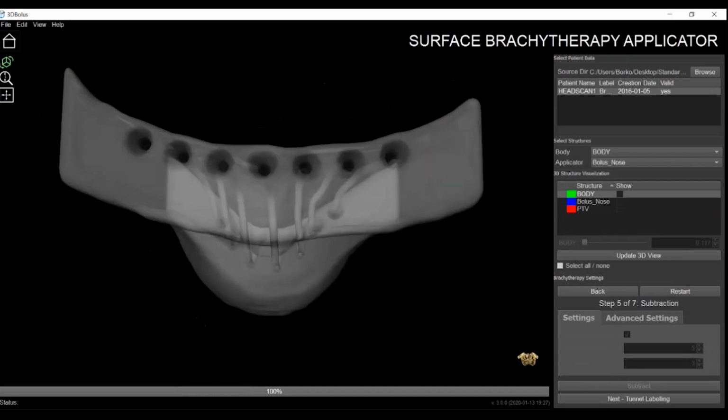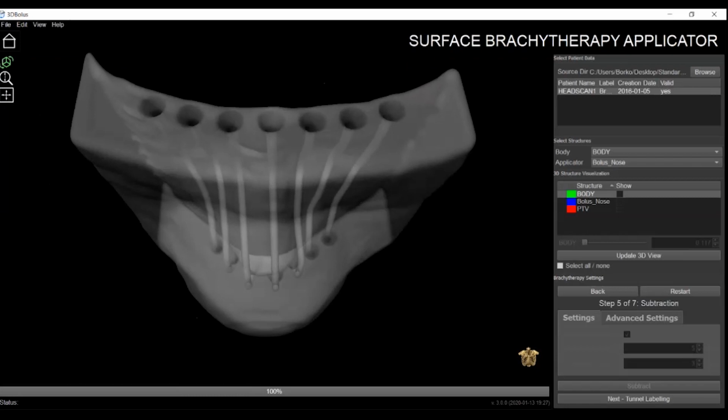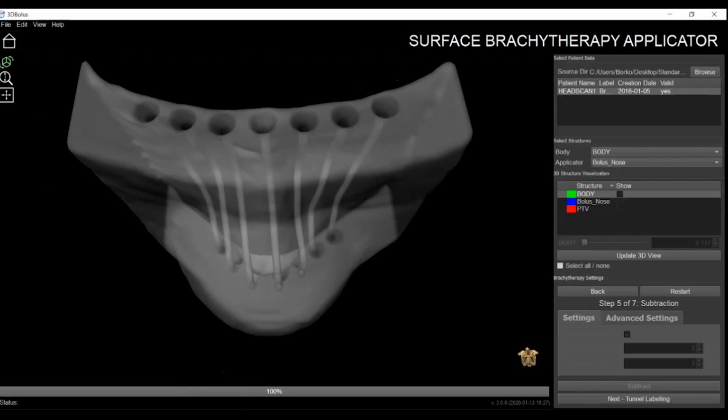But what is this feature used for? Why is it beneficial? This feature comes from the 3D printing part of the whole process. We have extensive experience, like 5,000 hours, on our printers.